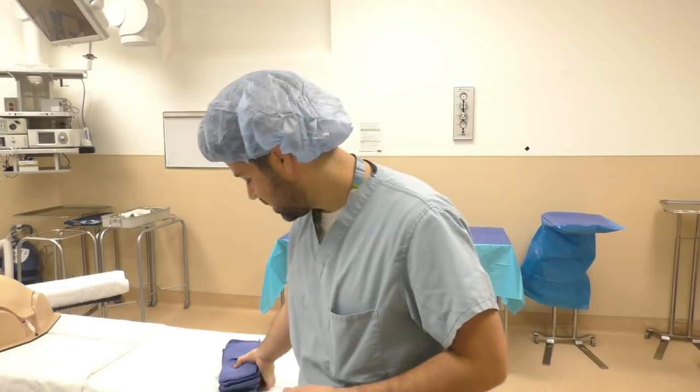Hey guys and welcome back to another Surgical Tech Tips. Today's video is going to be all about towels. Towels are something you'll utilize as a surgical tech for various different reasons during surgery and as you're setting up for surgery. I'm going to take you through layering up a back table and mayo stand for reinforcement, a variety of different roll towels for instrumentation, suture towel variations, and a couple different reasons you may use a towel depending on the case.